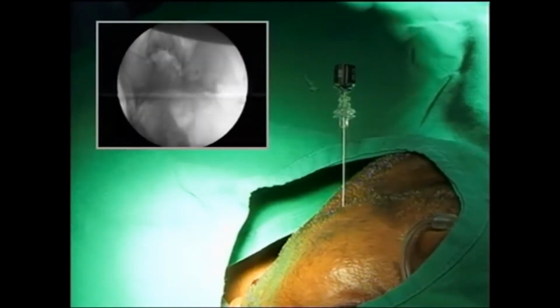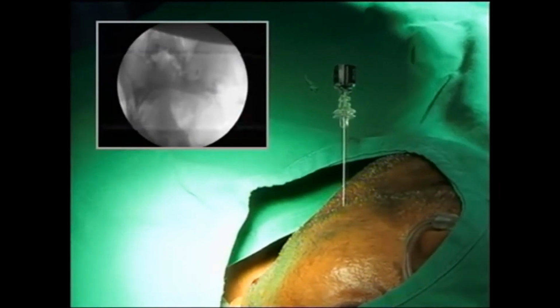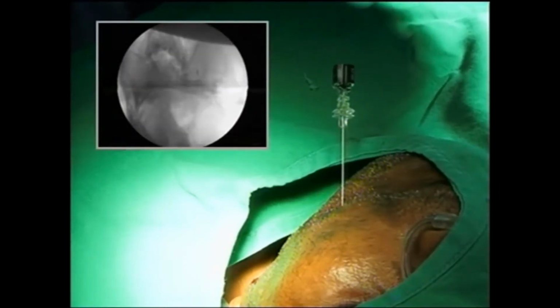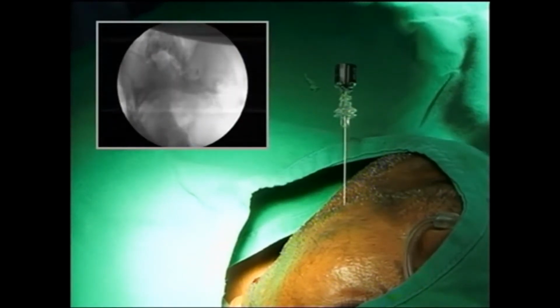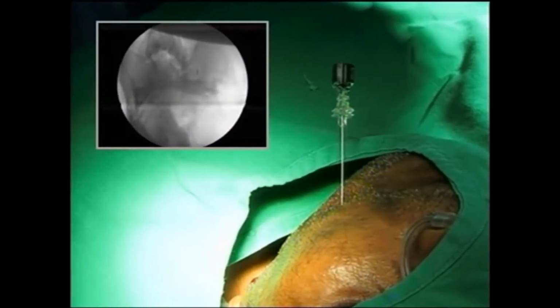Okay, so you can see that I've more or less reached an end-on view, and it's right in the middle of the foramen ovale. So I'm probably going to hit the wall of the foramen ovale. I'm probably going to dip it inside a little bit. Once I'm inside, I will know that I'm inside by feel.